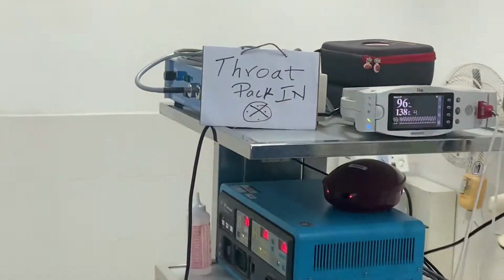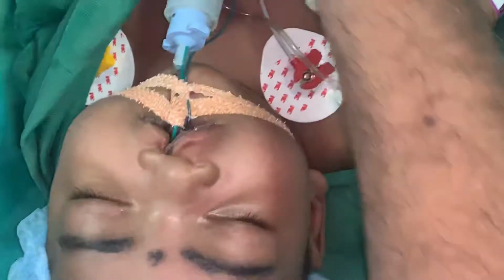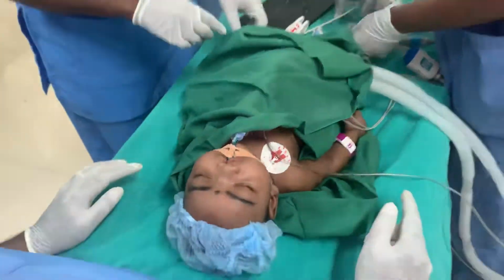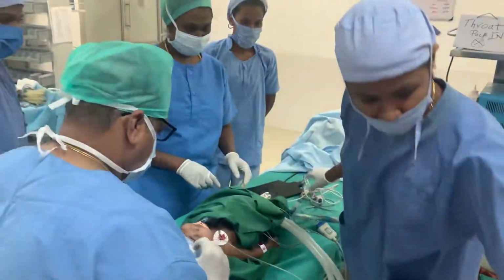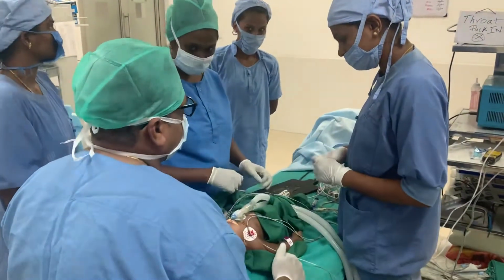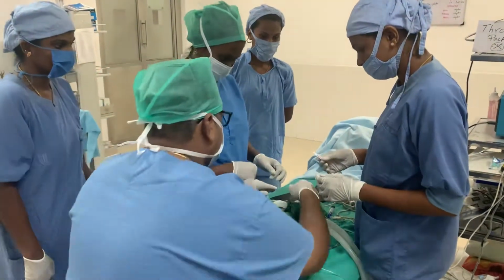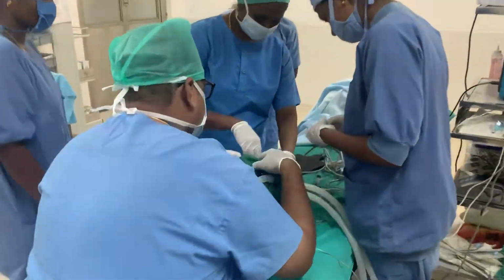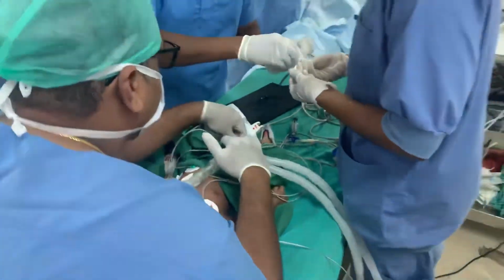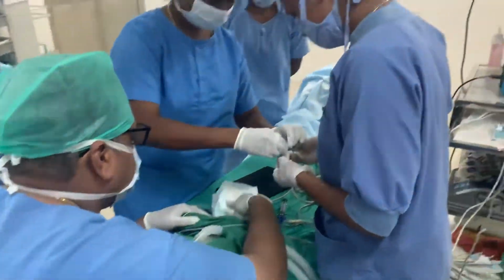So now it says it's in. So, keeping the suppository for analgesic purposes.